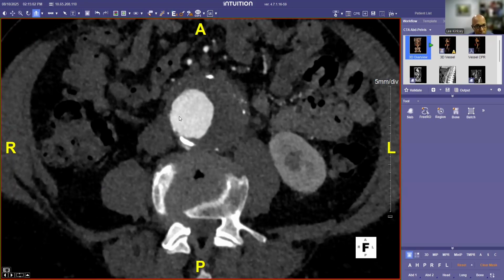We use this same software technology to evaluate patients with occlusive disease of the lower extremities. It's invaluable in preoperative planning for these patients in terms of strategies, which might involve open surgery, endovascular surgery, or some type of hybrid approach, employing both minimally invasive as well as surgical incisional approaches to a disease.